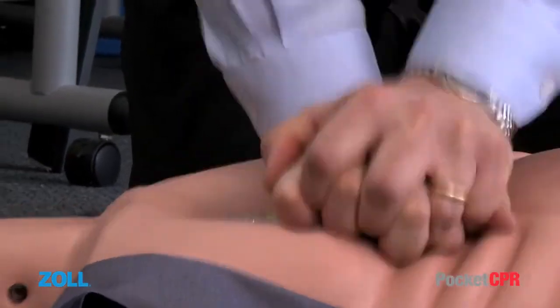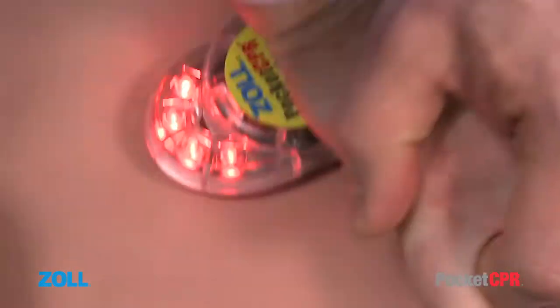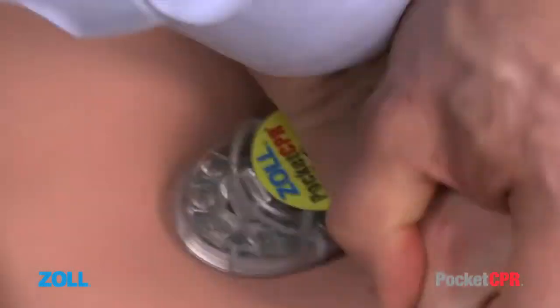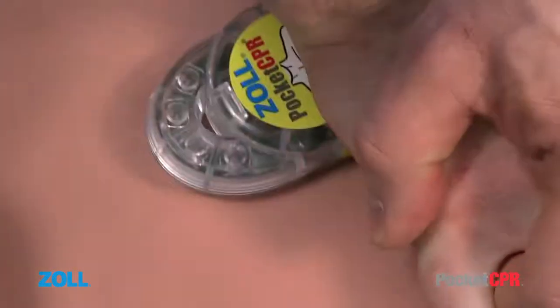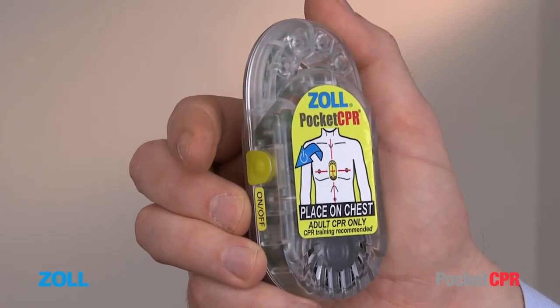If you're unable or unwilling to give 2 breaths, keep compressing the chest at the recommended rate of 100 per minute, at a depth of at least 2 inches or 5 centimeters. Good compressions. The breathing message and metronome will cycle and repeat until you power down the PocketCPR, which is done by pressing and holding the power button for 3 full seconds.